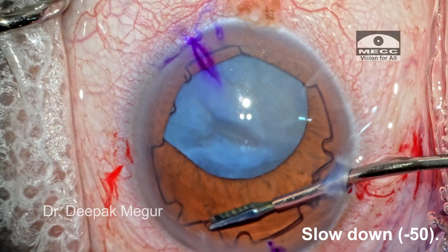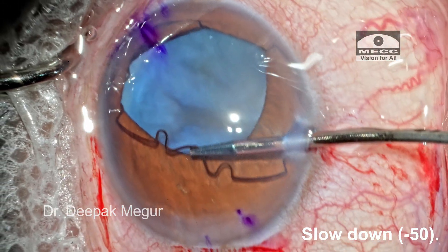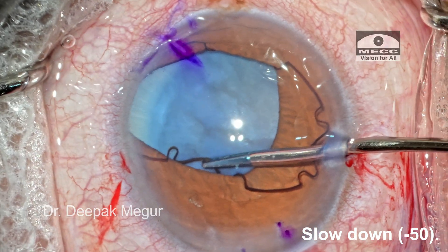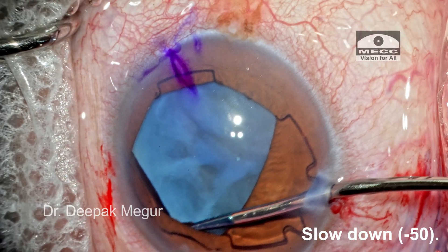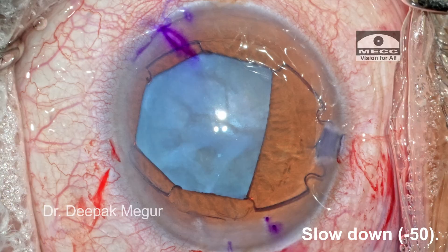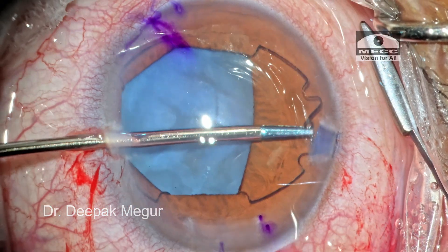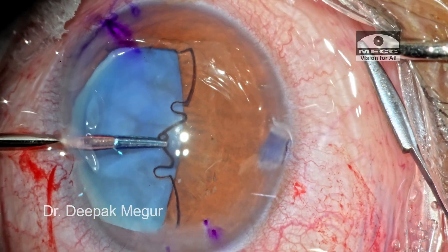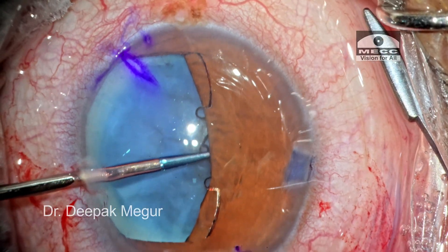Time to engage the second pair of notches — let's see this in slow motion. The forceps first engages the central hold within the W and the central part is pushed under the iris, engaging the two side notches. With the forceps in the same port, it is navigated to repeat the same maneuver to engage the third pair of notches. The maneuver and handling are just similar to the B-hex, so with a single entry, three pairs of notches can be engaged very quickly. The last pair requires switching hands — the central hold of the W is held and maneuvered gently below the iris to engage the final pair of notches.